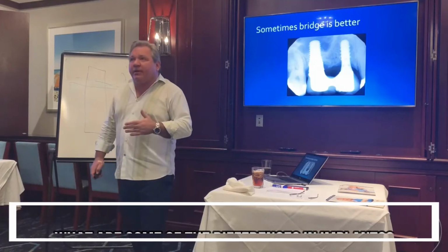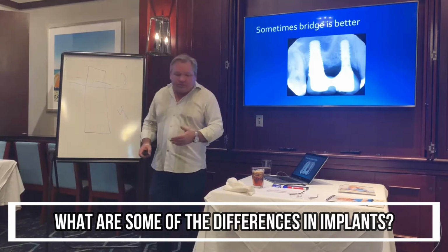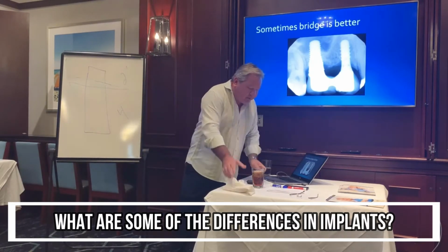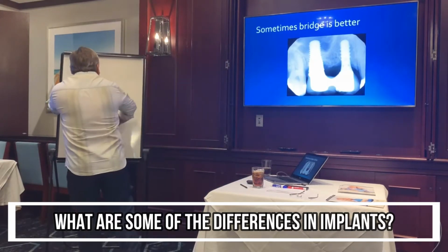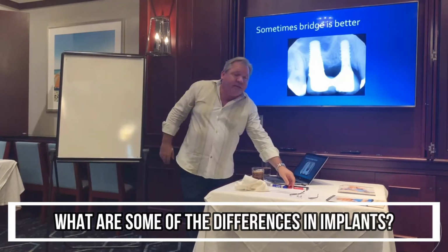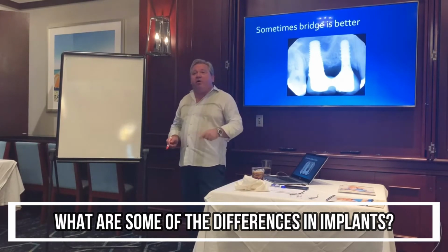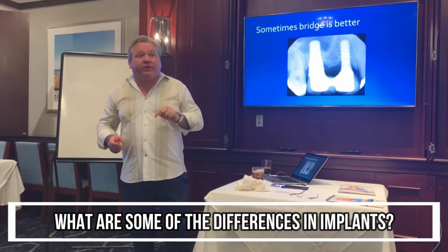I put this slide in to point out, visually, some of the difference in implants. When we go into the lower jawbone to place an implant, it's like going into a block of maple wood. When we go into the upper jawbone to place an implant, it's like going into a block of styrofoam. That's the difference in density of bone between the upper and the lower. Treating the upper arch is different than treating the lower arch.